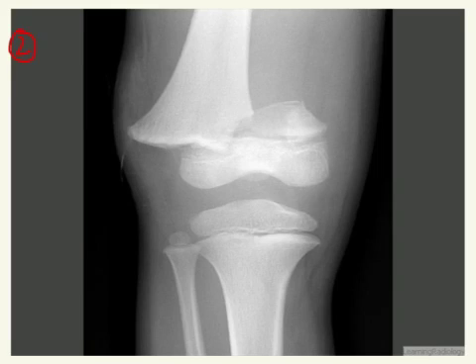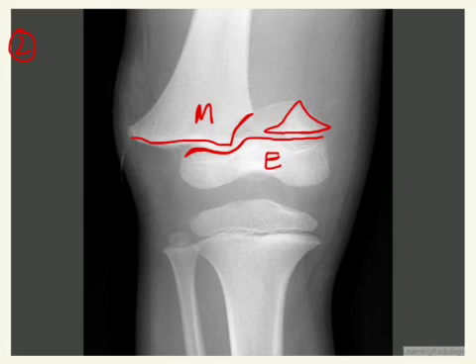This one is also pretty markedly displaced, but we can see here that there is your metaphysis, here is your epiphysis, and you have part of that fracture here. So this is the one that is above, and so this is going to be a Salter-Harris 2.